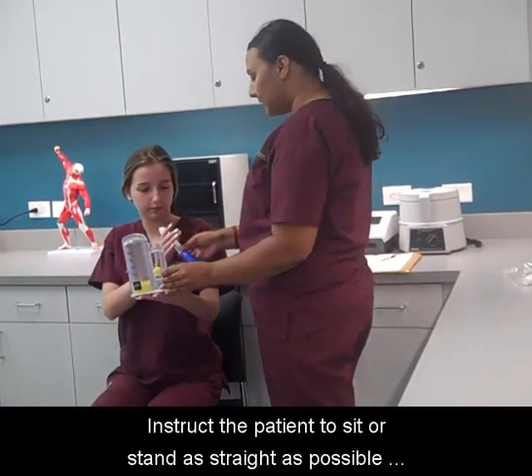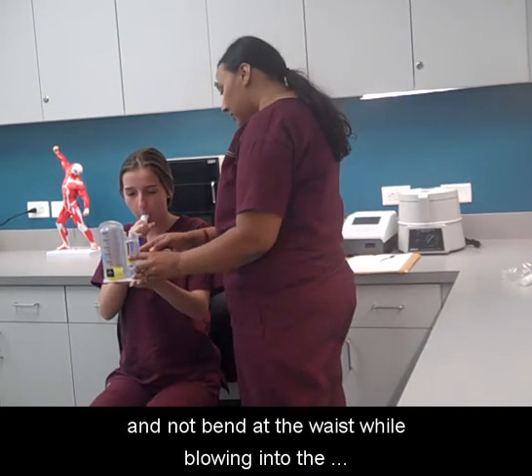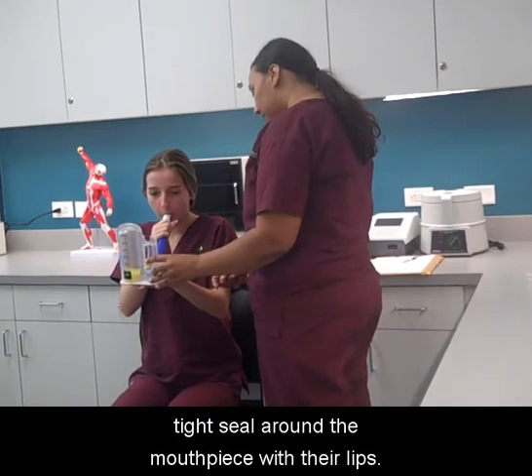Instruct the patient to sit or stand as straight as possible and not to bend at the waist while blowing into the disposable mouthpiece. Instruct the patient to make a tight seal around the mouthpiece with their lips.